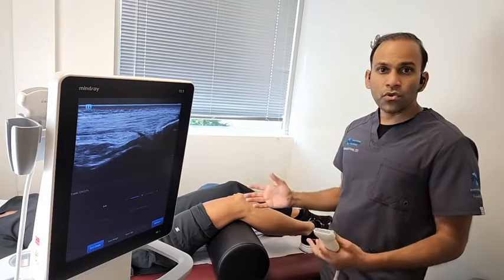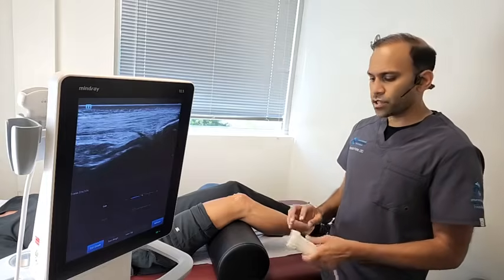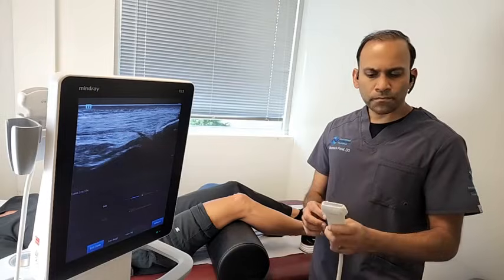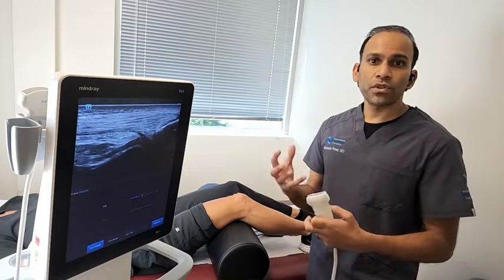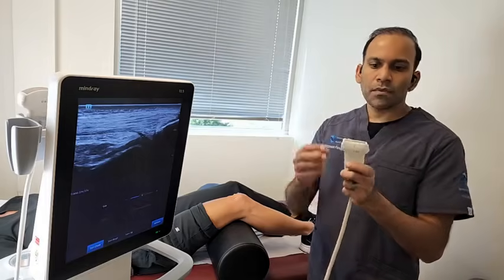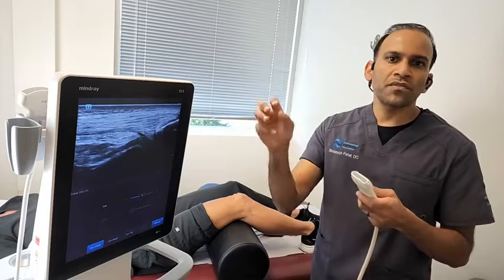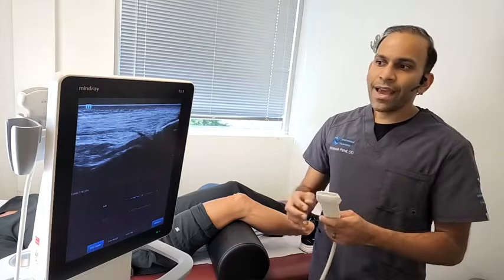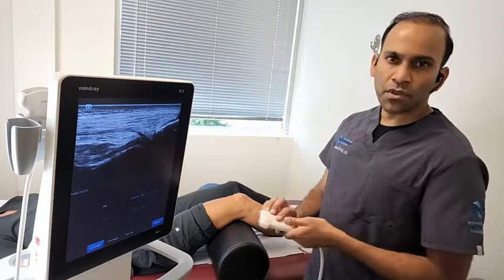So without further ado, I'm going to go over some of the knee anatomy as I go along, and I'm going to go through basically how I use ultrasound to look at the whole knee as a picture. Now, before I go on, just to tell you what ultrasound is: it's a device that uses sound waves to reproduce images of the inside of your body. This device sends sound waves into the body, and those sound waves bounce off of different structures, come back to this probe or transducer, and that gets interpreted as images on the screen. And I'm going to point out what some of those things look like.